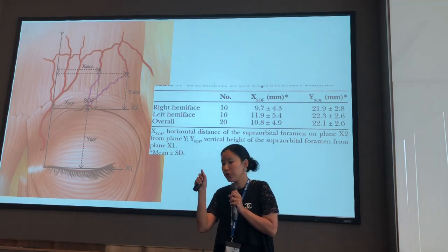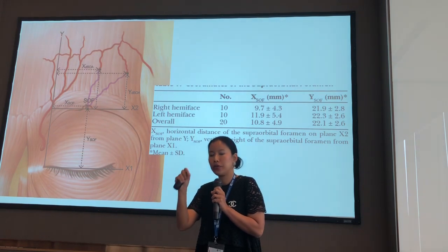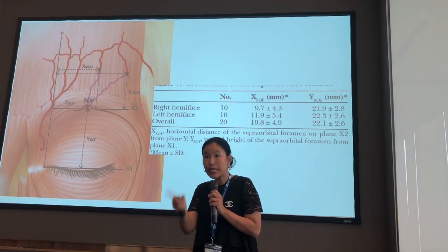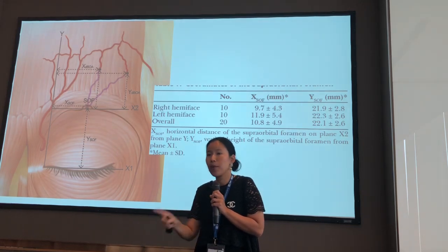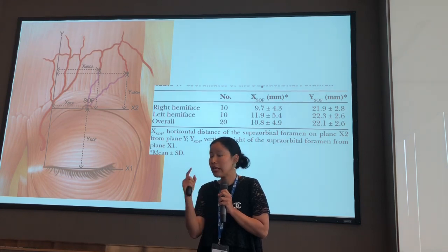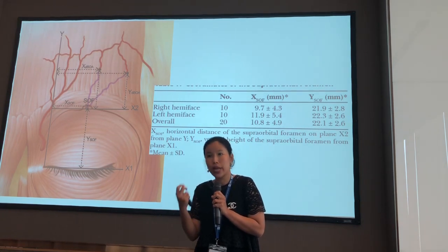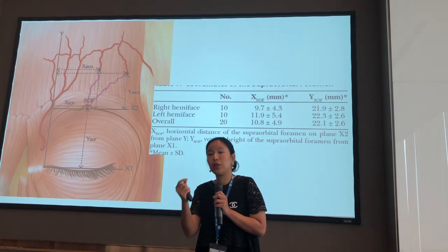And if you put your finger on the area and you can feel the pulse, it means the artery is there. So there's no need for memorizing things, just your finger. And even in a case with variation, you can still feel the right area of the notch and the artery.